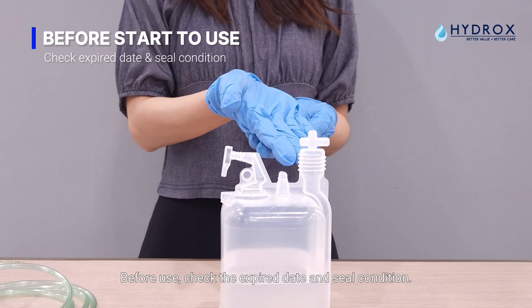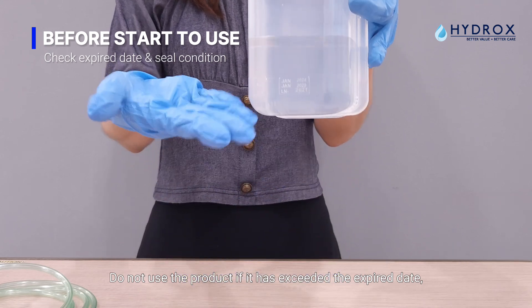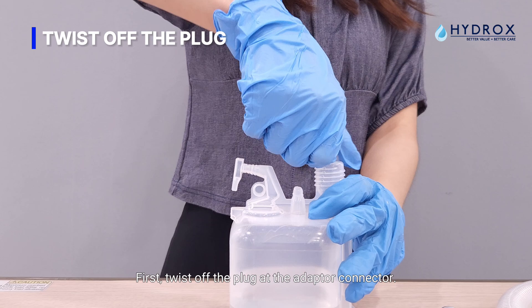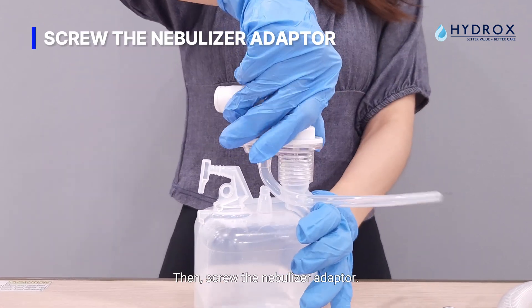Before use, check the expiry date and seal condition. Do not use the product if it has exceeded the expiry date or the seal is damaged. First, twist off the plug at the adapter connector. Then, screw on the nebulizer adapter.